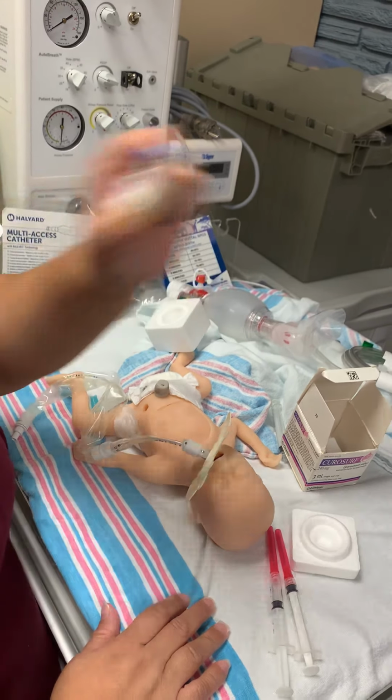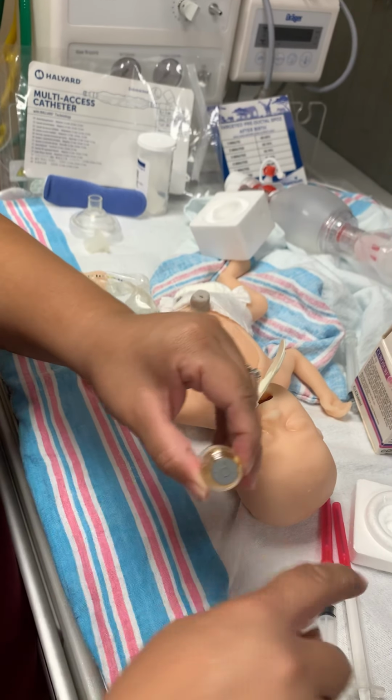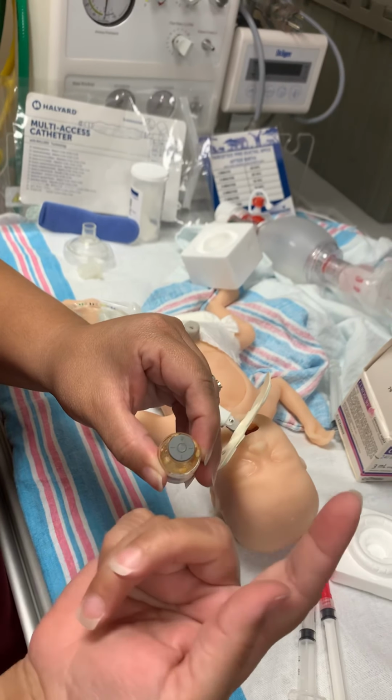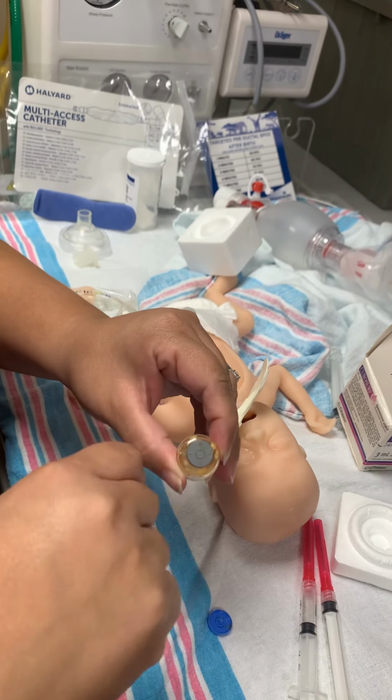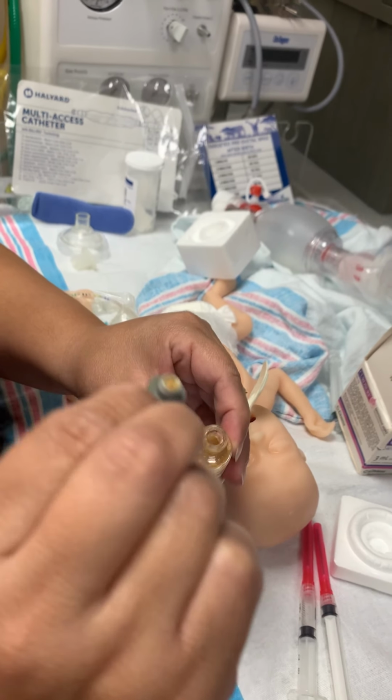So it does have the protective cap. Then we end up with this rubber stopper. So with the rubber stopper, this one is missing the metal piece that protects it, that keeps the stopper in, but we need to take that metal piece off with hemostats, or if you pop your plastic off appropriately, it actually leaves a little metal piece up a little. So we take that metal piece off because the end goal is to remove the entire stopper.